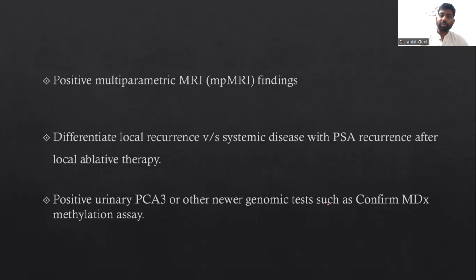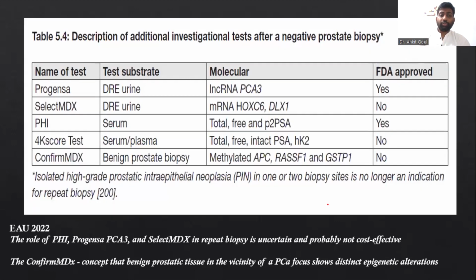So all these indications are recommended by the AUA. And the last thing we have to talk about is the PCA3 and the ConfirmMDx. We'll talk about them now. This is what the FDA approves.